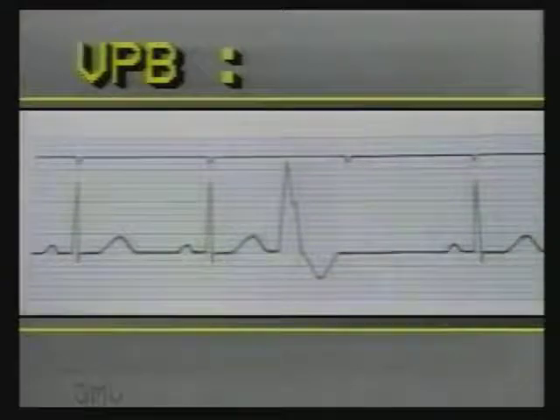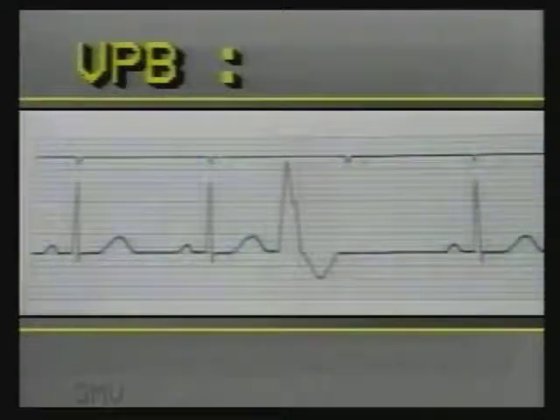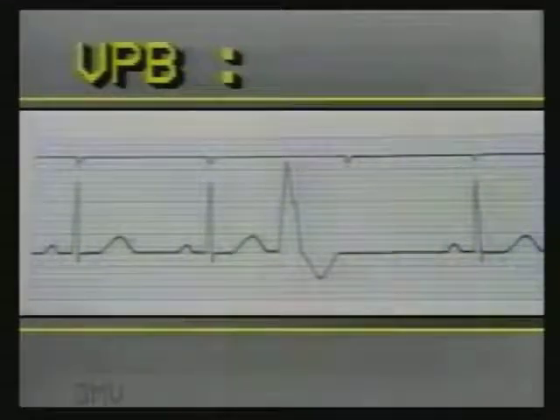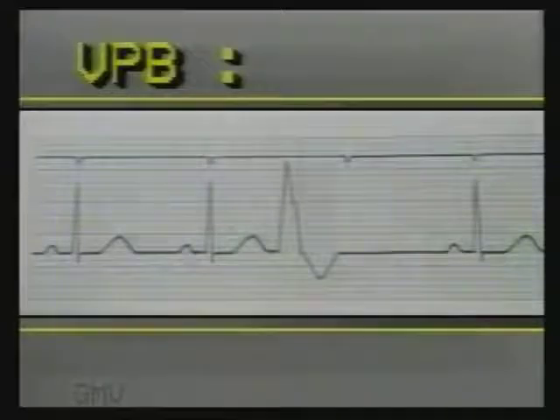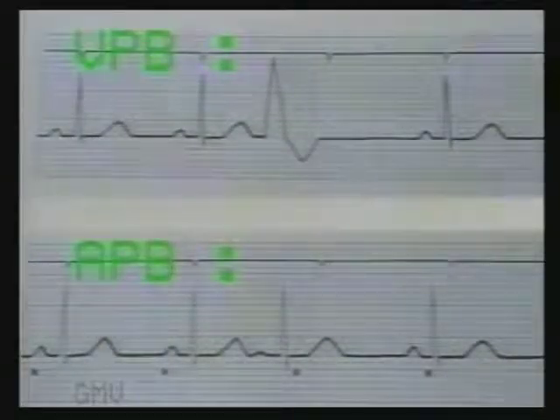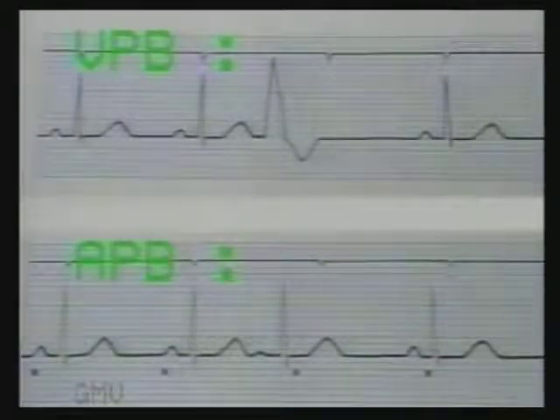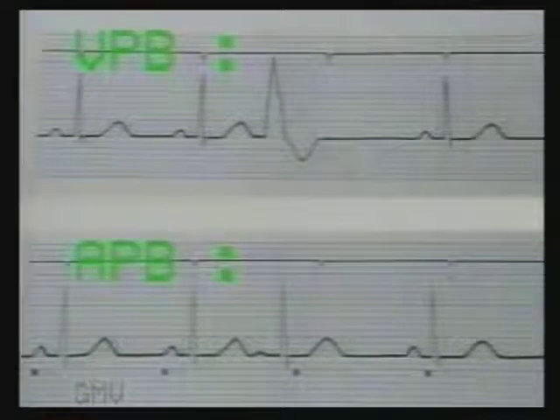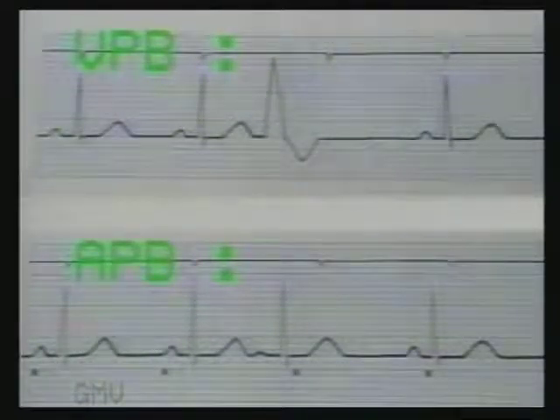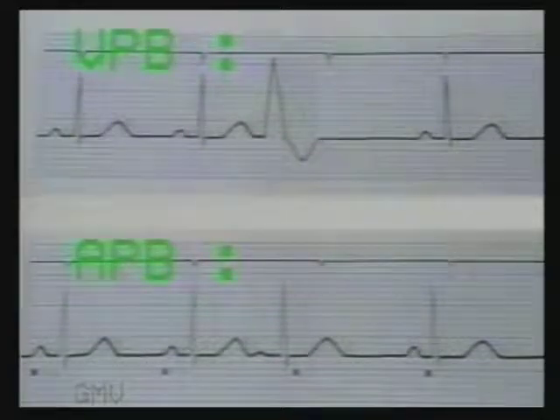Ventricular premature beats have a complete compensatory pause, as the impulse arising in the ventricles does not affect the rhythm of the SA node. In contrast, an impulse arising in the atrium will depolarize the SA node early, disturbing its rhythm. And hence, the next impulse from the SA node will come earlier than the expected next beat.